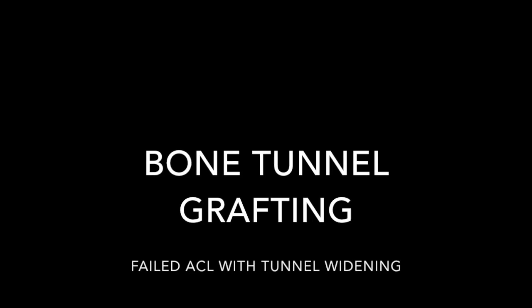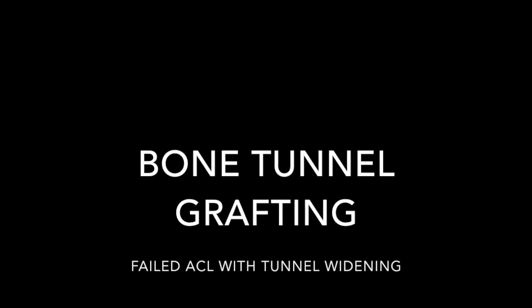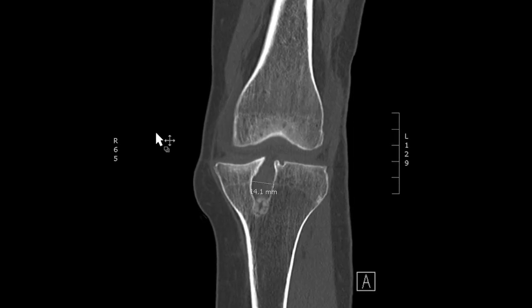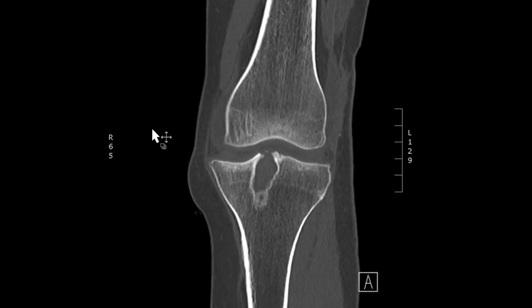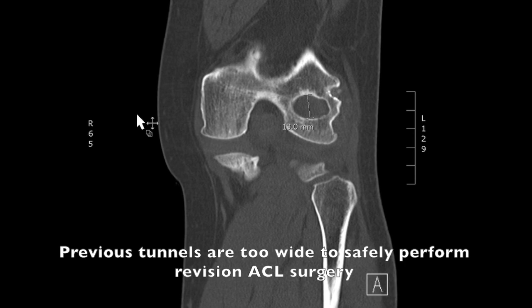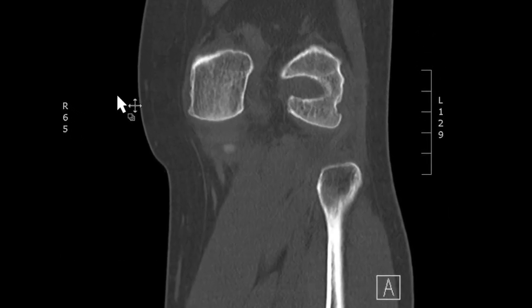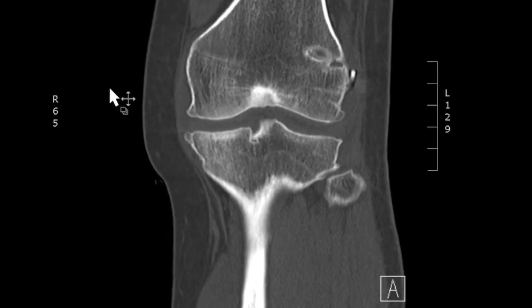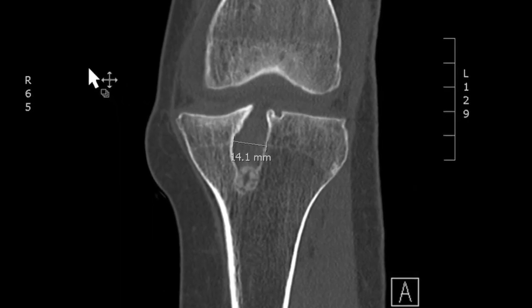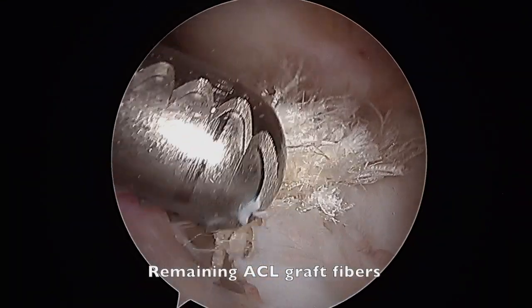This is a case demonstrating bone tunnel grafting after a failed ACL. The CT scan of the left knee demonstrates widening of both the femoral and tibial tunnels after her previous ACL surgery. This amount of widening leads to a significant risk of failure after revision surgery.